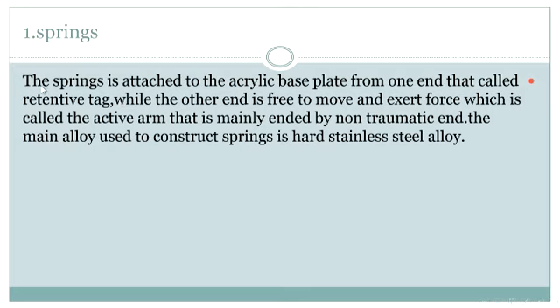Springs: the spring is attached to the acrylic base plate at one end, which is called the retentive tag, while the other end is free to move and exert normal physiological force, called the active arm, which mainly ends with a non-traumatic end.